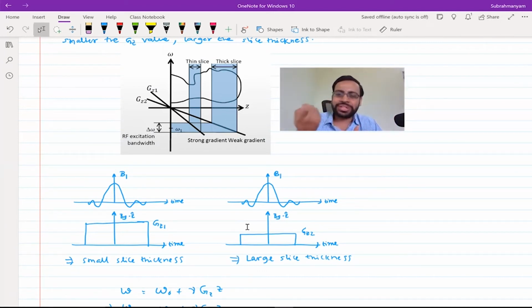Your z resolution is very small, so the number of slices you would get in the z direction would be very small. I have not talked about the xy gradients, which would give you the resolution in the xy plane. But in the extreme case you would get almost a 2D image. Does anyone else have any questions here?